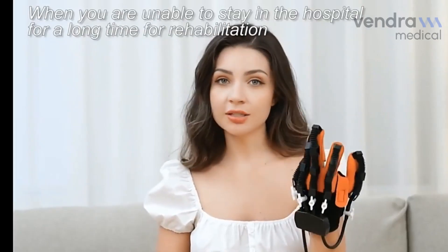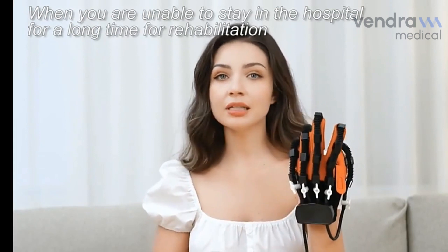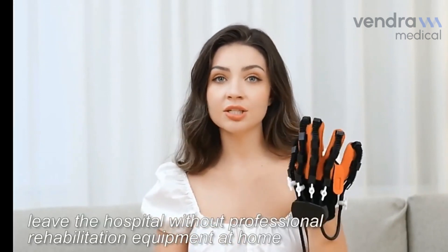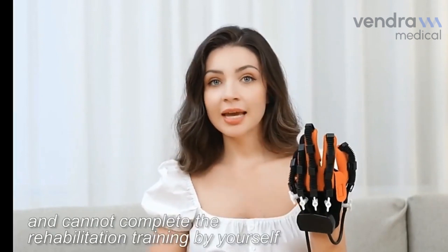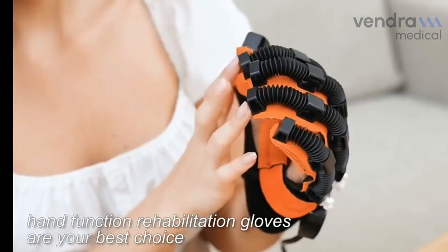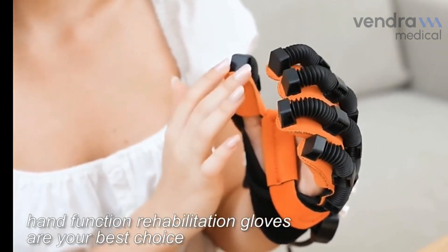When you are unable to stay in the hospital for a long time for rehabilitation, leave the hospital without professional rehabilitation equipment at home, and cannot complete the rehabilitation training by yourself, Hand Function Rehabilitation Gloves are your best choice.